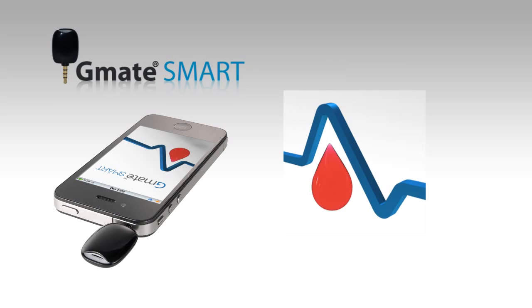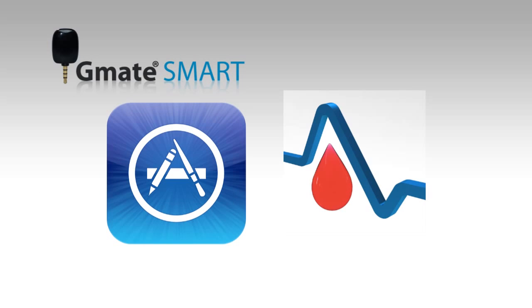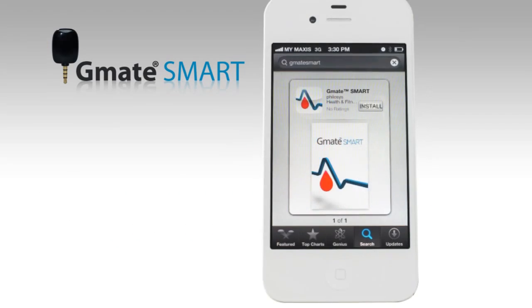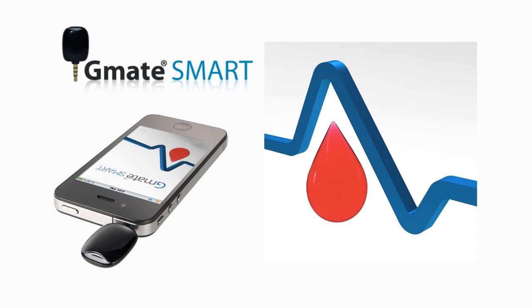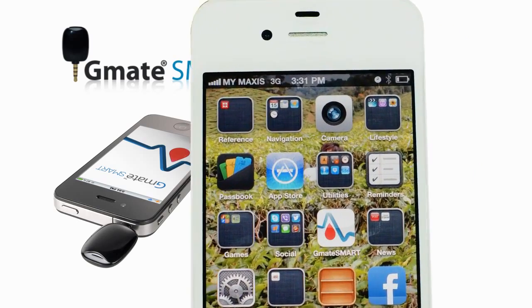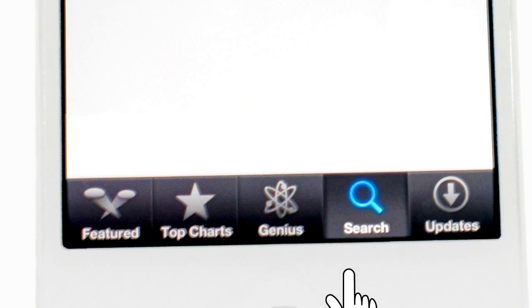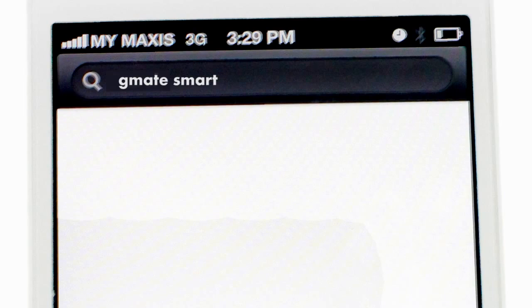With a simple download of the free G-Mate Smart app from the iTunes App Store, the G-Mate Smart interfaces directly with the iPhone operating system. The application is a free download. To download directly on your smartphone, tap on the App Store icon, select the Search tab at the bottom of the screen, then type G-Mate Smart into the search bar at the top.